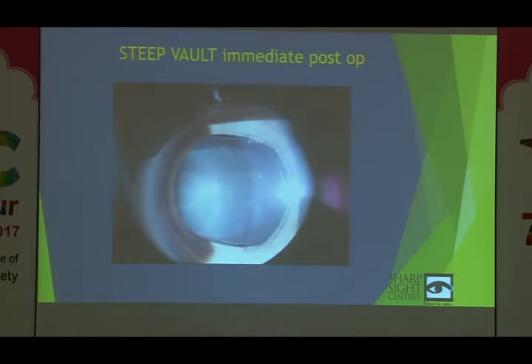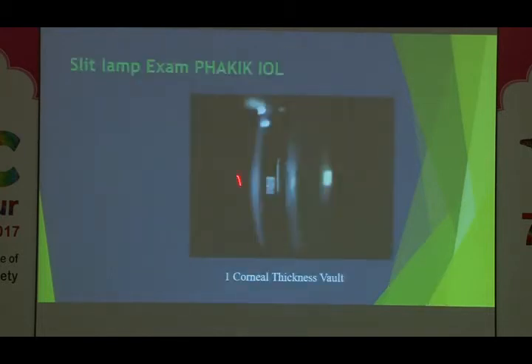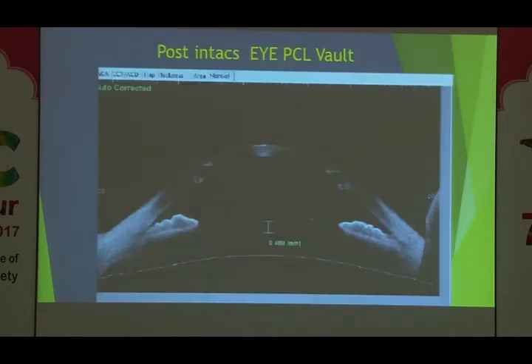I would recommend don't use pilocarpine in such patients. If you anticipate a higher vault, don't use pilocarpine. There's viscoelastic. This will automatically go within 2 days. If you put pilocarpine, these are the patients who probably will have a higher IOP and IOP spike. The best way to check your vault, in case you don't have an OCT, is the thickness of the cornea. The same thickness you should get between the crystalline lens and the IPCL, approximately 500 microns, great to go. 488 microns, this is what is meant by a vault.